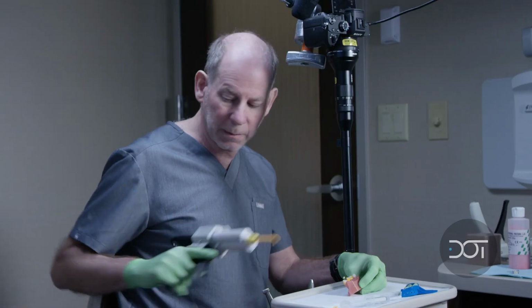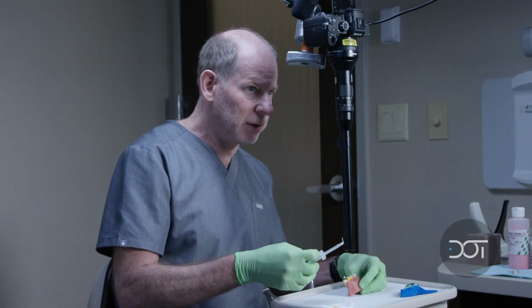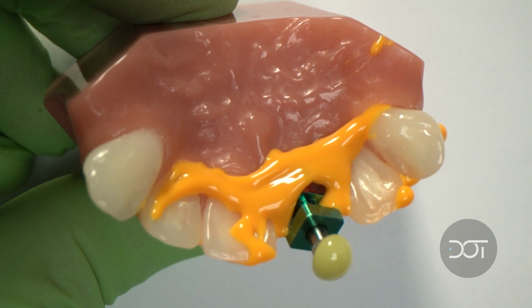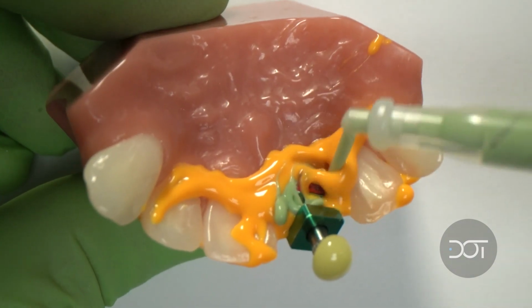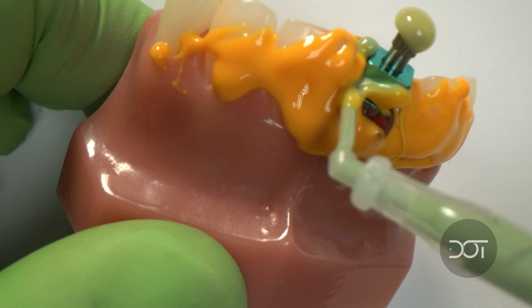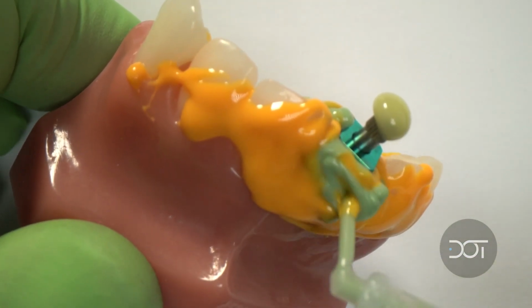Now at this point, I'm going to pull out my heavy body material in this disposable syringe. I'm going to bleed this material first. I'm going to come in and I want to make sure that I'm engaging into these undercuts, into these retentive areas with this heavy body material.